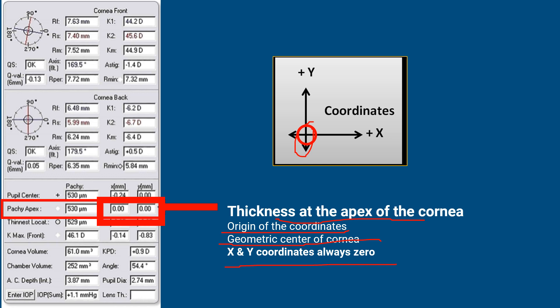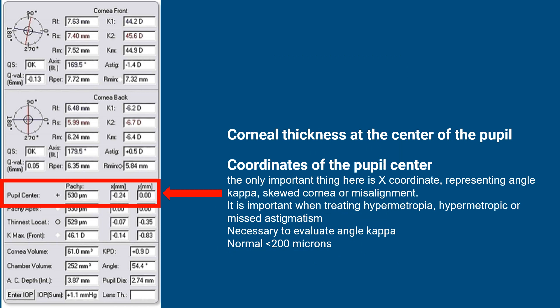At the pupil center, the important value is the X coordinate, which represents angle Kappa, a skewed cornea, or misalignment. The normal value is roughly less than 200 microns. This is necessary to evaluate angle Kappa.